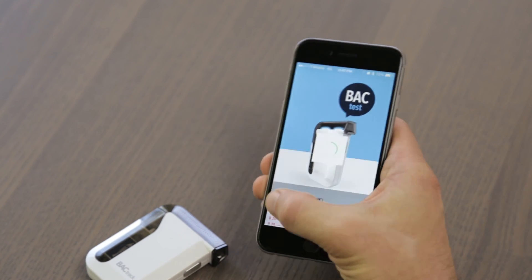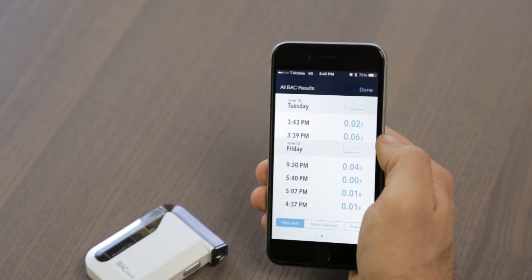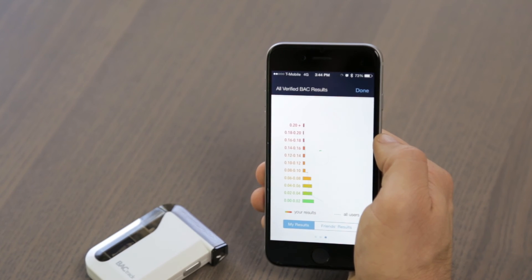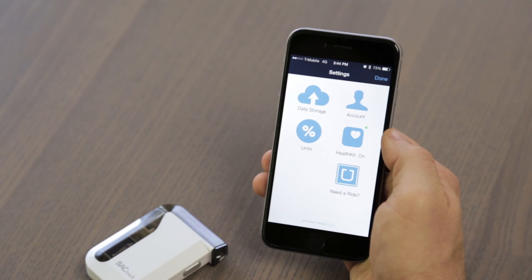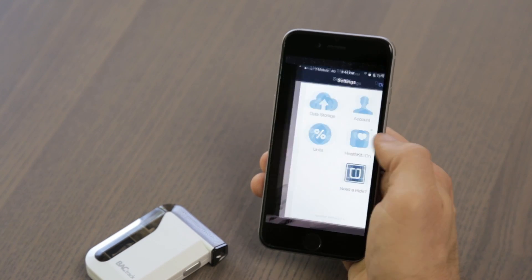On the app home screen, there is access to additional BAC testing data, BACtrack's worldview, as well as user account settings. Here, you can choose how much, if any, of your data is shared. By default, all data sharing is turned off. The BACtrack app is also seamlessly integrated with Apple HealthKit, as well as the Uber app, allowing you to request a ride home if you, or a friend, have had too much.